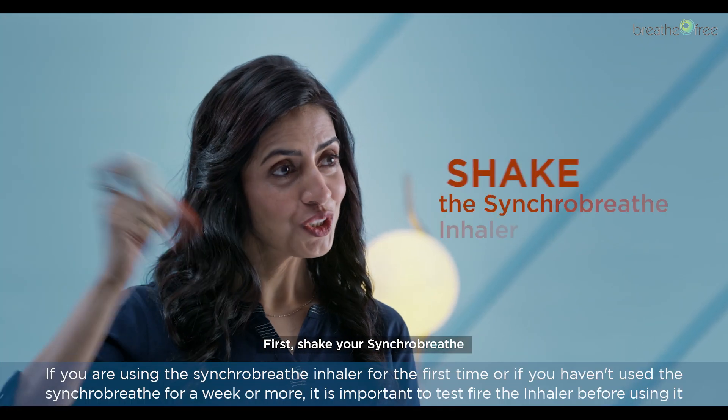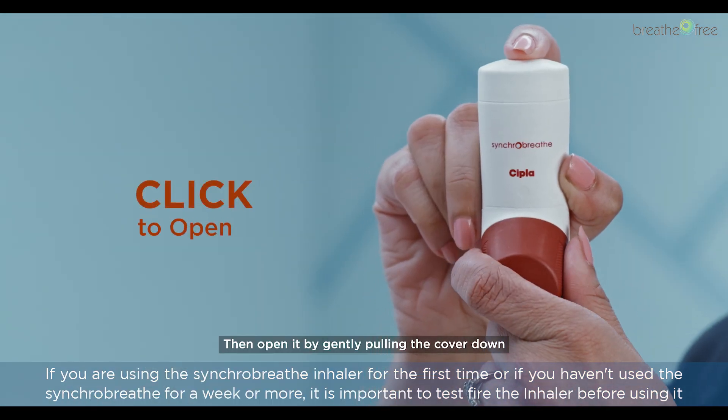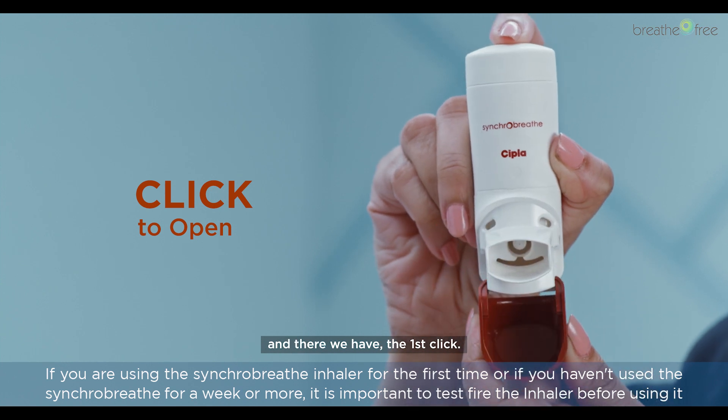First, shake your SynchroBreathe keeping the mouthpiece cover closed. Then open it by gently pulling the cover down — and there we have the first click.